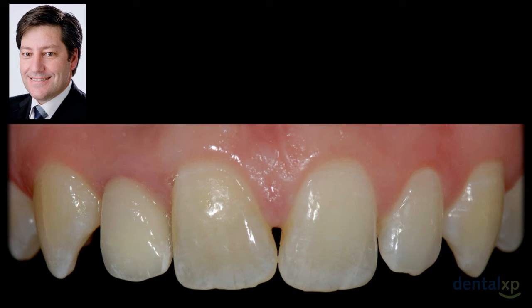Because we do not place implants, we do not handle the soft tissue just for the sake of doing it. We do all that to restore a missing tooth. So this is the most important part of the complex. Of course, I'm a prosthodontist, and I have to say that. But the implant, ideally, should not be noticeable. The soft tissue should look natural. But this is the only thing, your prosthetic work, that we cannot hide. And therefore, it is where your attention should be the highest.